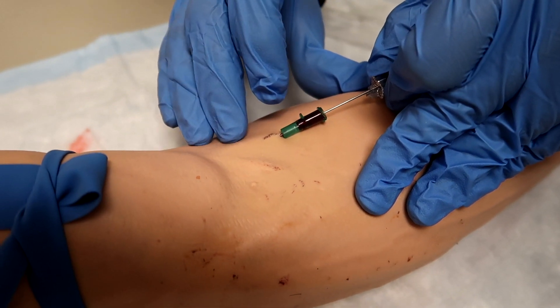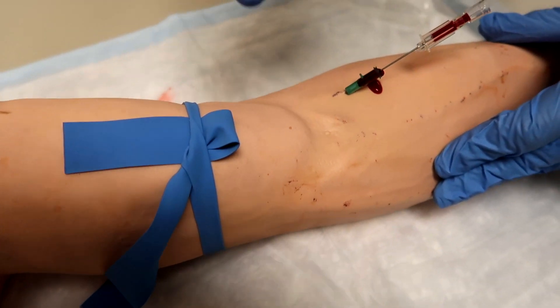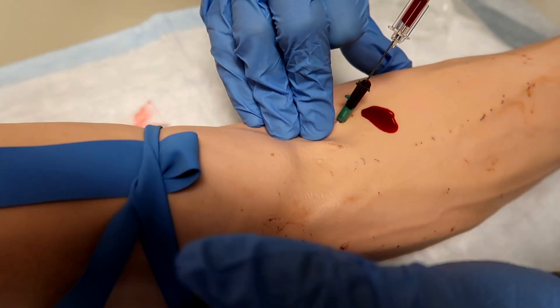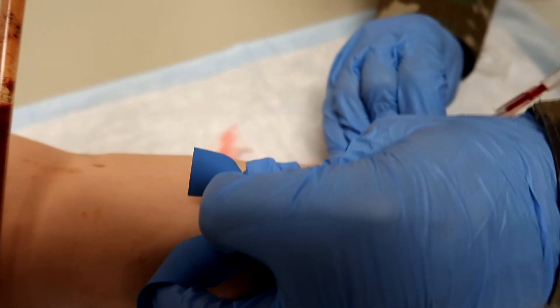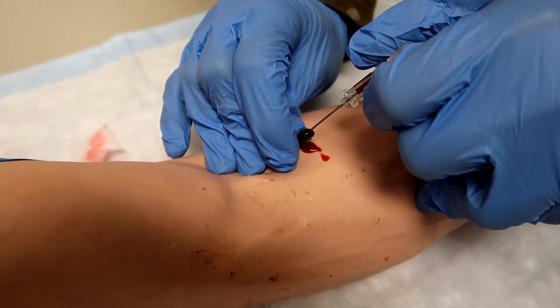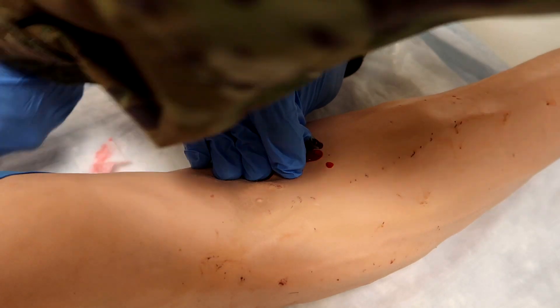Now release the constricting band with the non-dominant hand. My personal trick is to use three fingers from your non-dominant hand to occlude and stop the bleeding, then grab onto the hub of the catheter and pop the constricting band. Once you do that, occlude the vein with the non-dominant hand to prevent bleeding. Now remove the needle and place it in the sharps container.